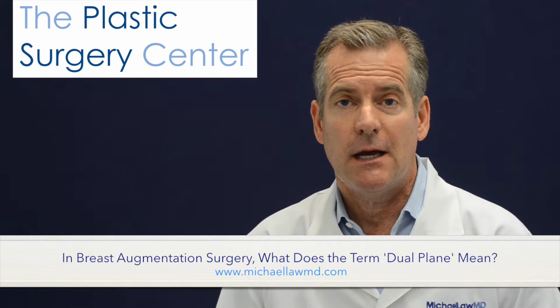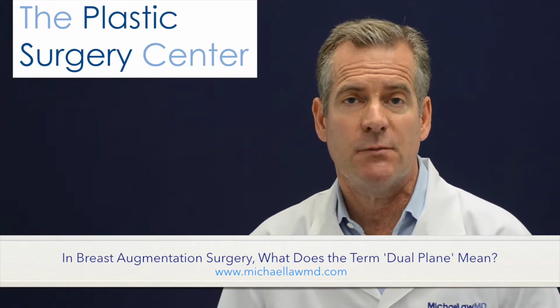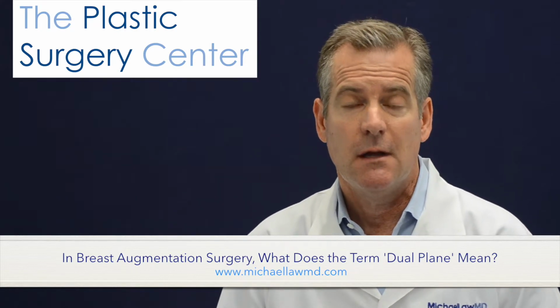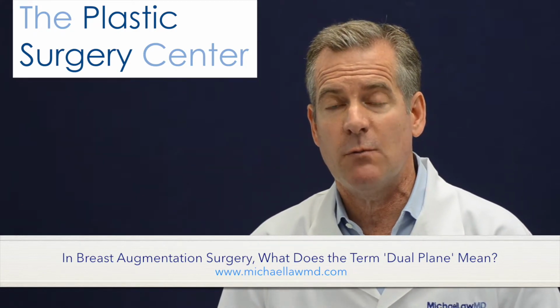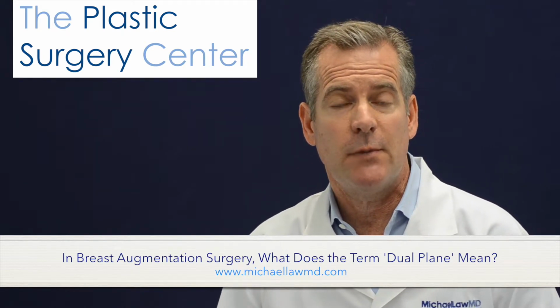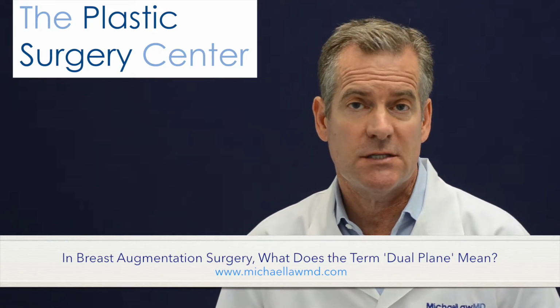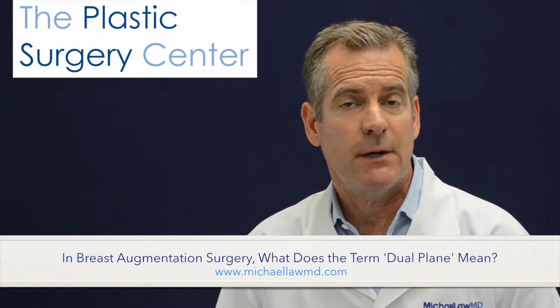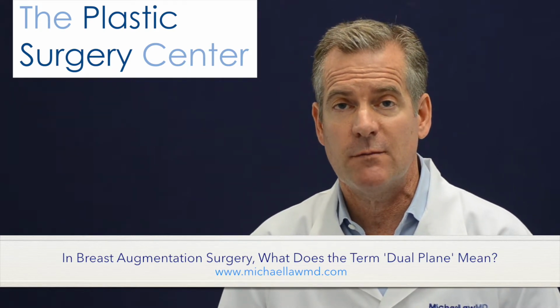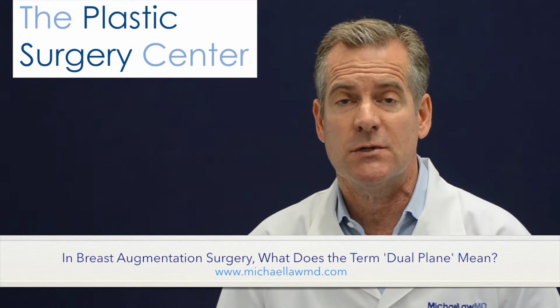muscle. Now, the nature of the pec major muscle anatomy is such that it is almost impossible to have complete coverage of a breast implant with the pec major muscle. Also, there are some compelling reasons why one should release part of the pec major muscle so that when the pec major muscle contracts, implant position doesn't change significantly. If a subpectoral augmentation is done and there is not adequate release of the muscle across the inframammary fold, the breast implant will tend to animate or jump around when the muscle contracts.